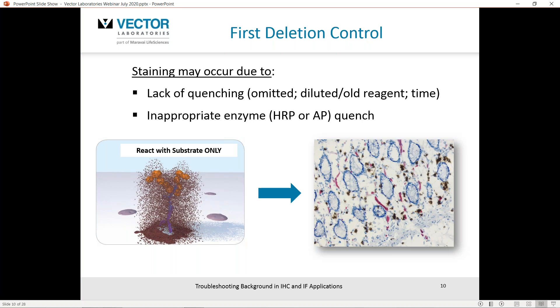If there is staining with that first deletion control, it may be due to lack of quenching, old reagent, a concentration issue, or a time issue. Make sure you're quenching for the appropriate enzyme based on the methodology you're using — whether it's peroxidase or alkaline phosphatase.